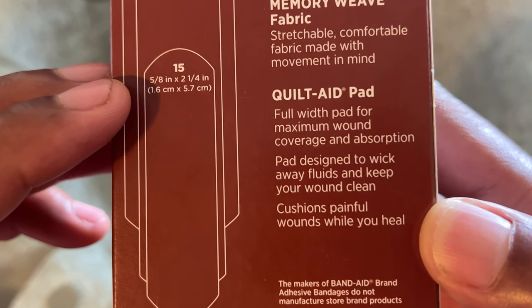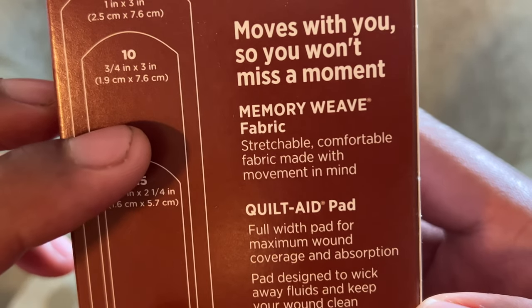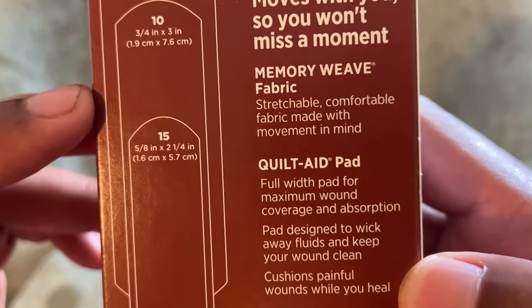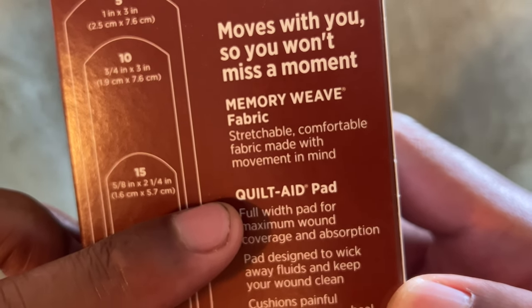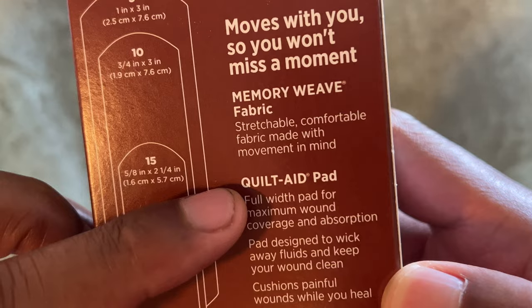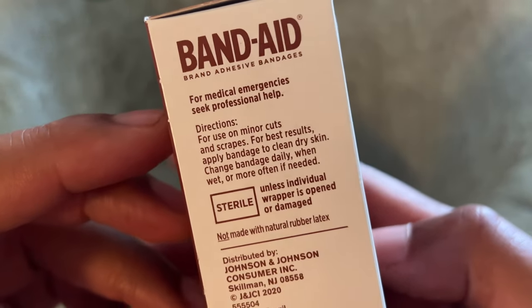It cushions painful wounds while you heal — I'm into that. Memory weave fabric, so the fabric has a memory I'm guessing. It says 'stretchable comfort fabric made with movement in mind.' I'm going to go ahead and open these up. It says they are sterile.